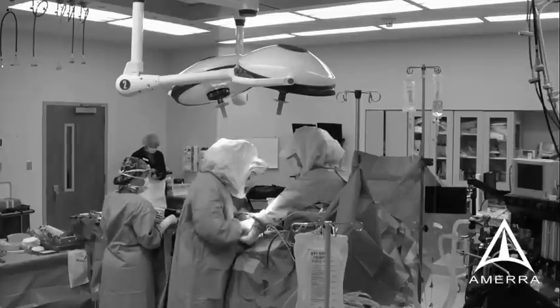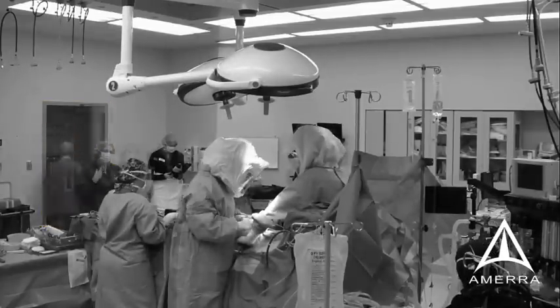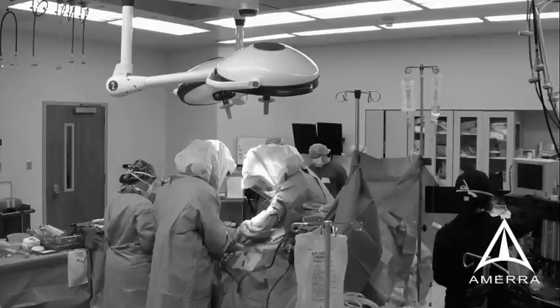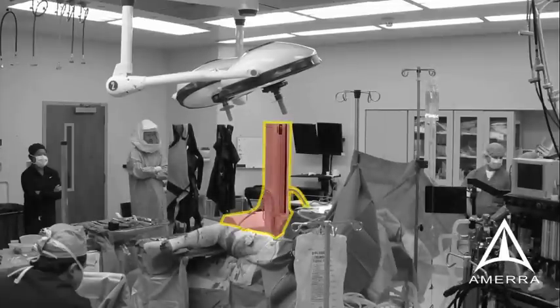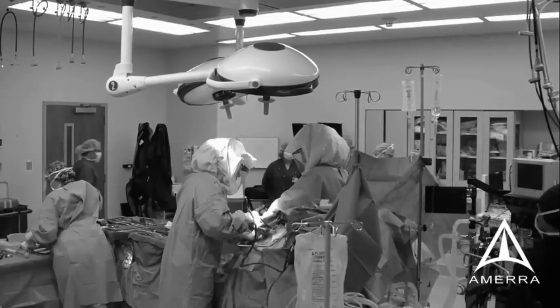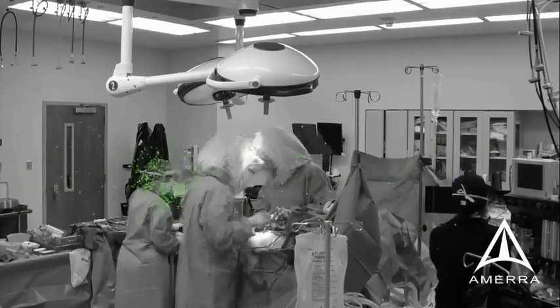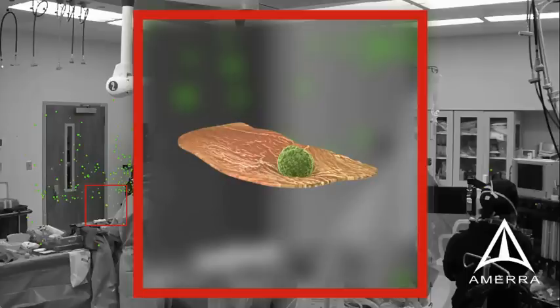Many common operating room dynamics create these disturbances: the opening and closing of doors, the choice of ventilation systems, overhead operating room lights, anesthesia machines, portable x-ray machines, and most importantly, room traffic and the movement of people. All of these disruptions cause the airflow patterns to become erratic, potentially bringing high numbers of infection-causing bacteria in contact with the surgical site.